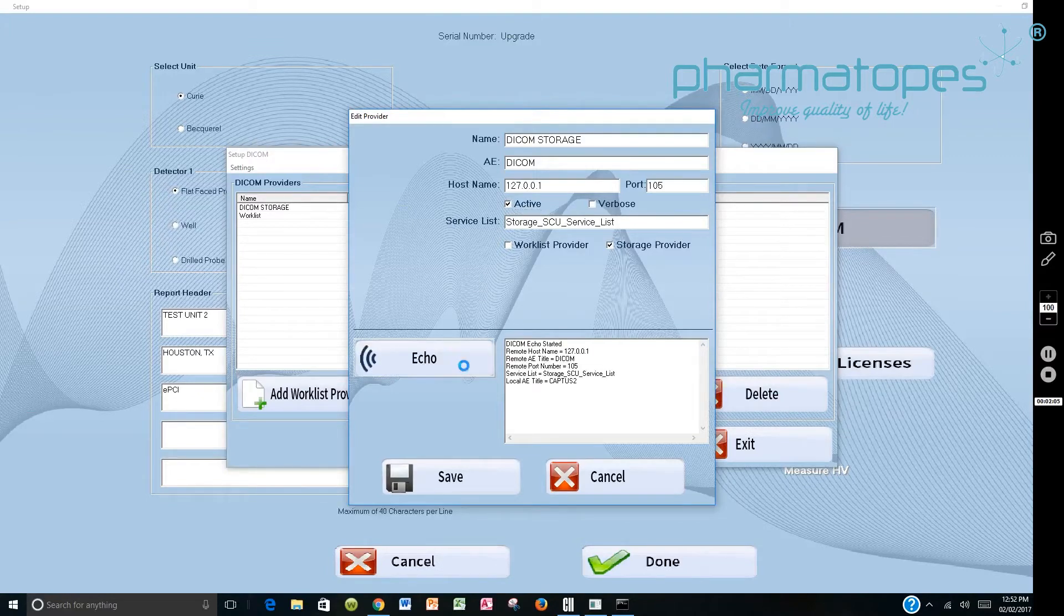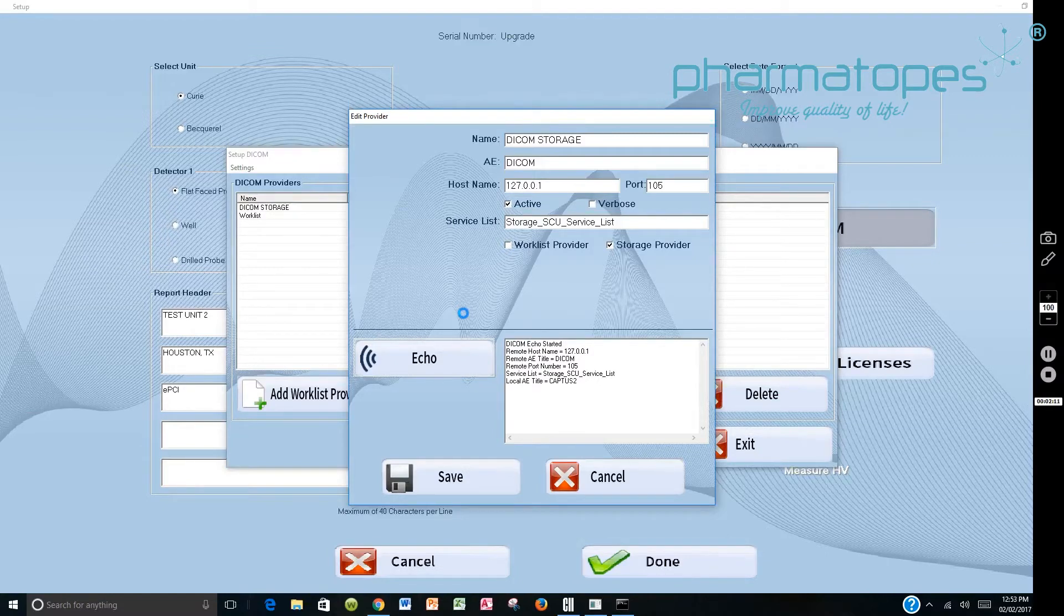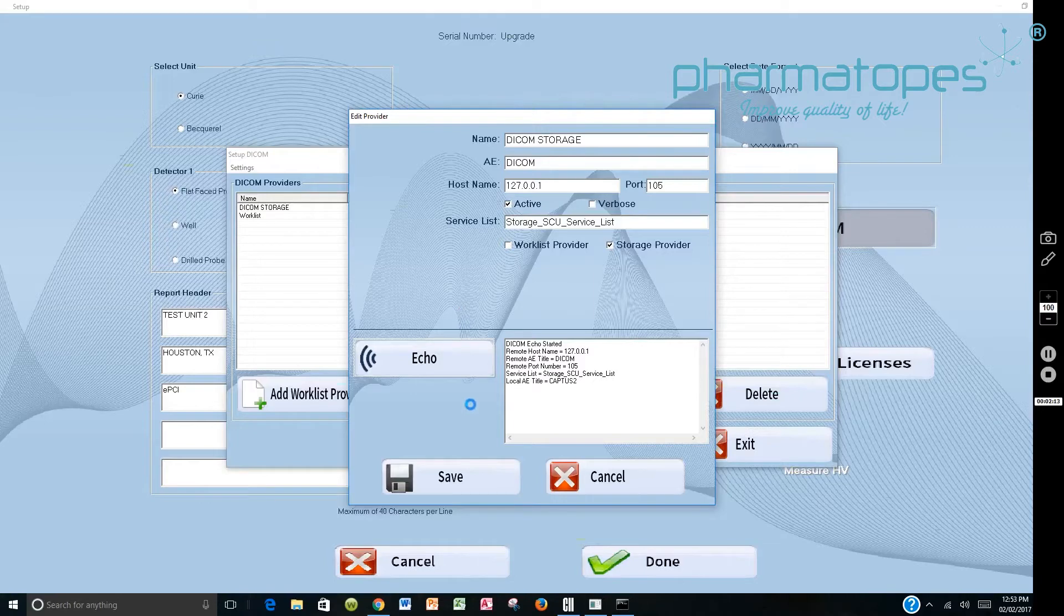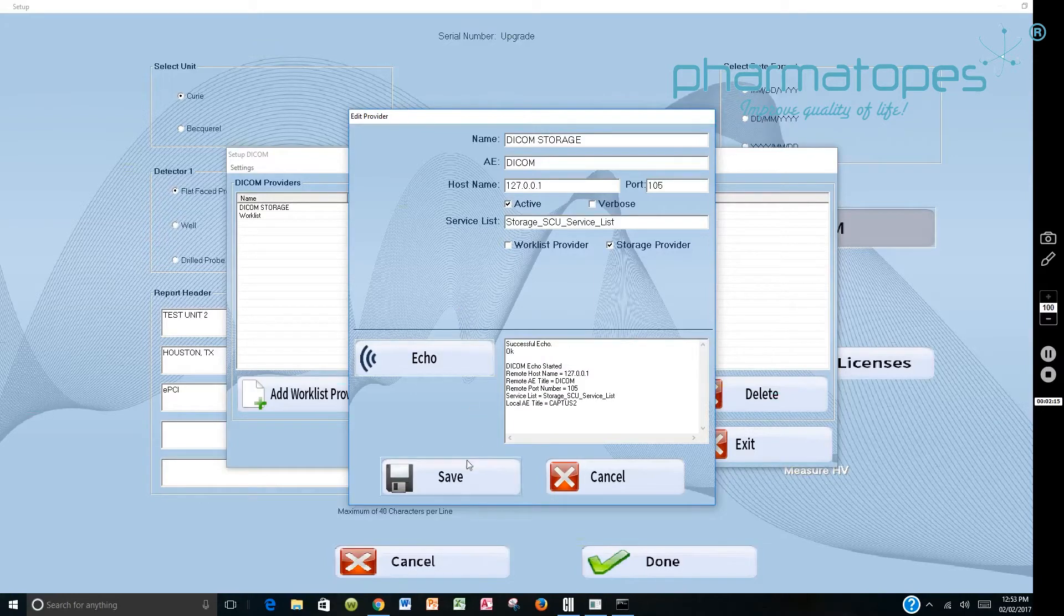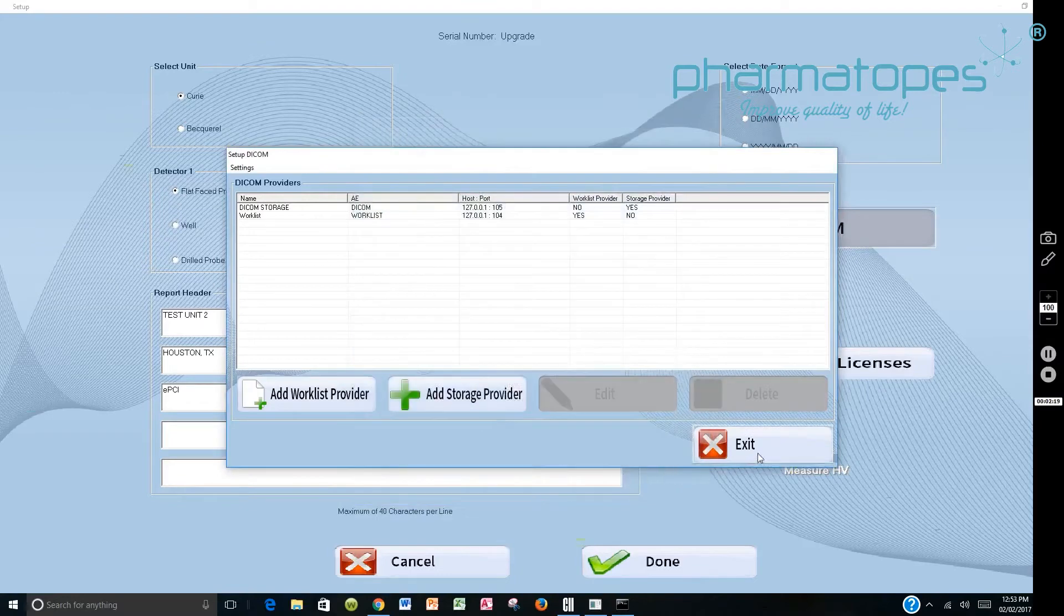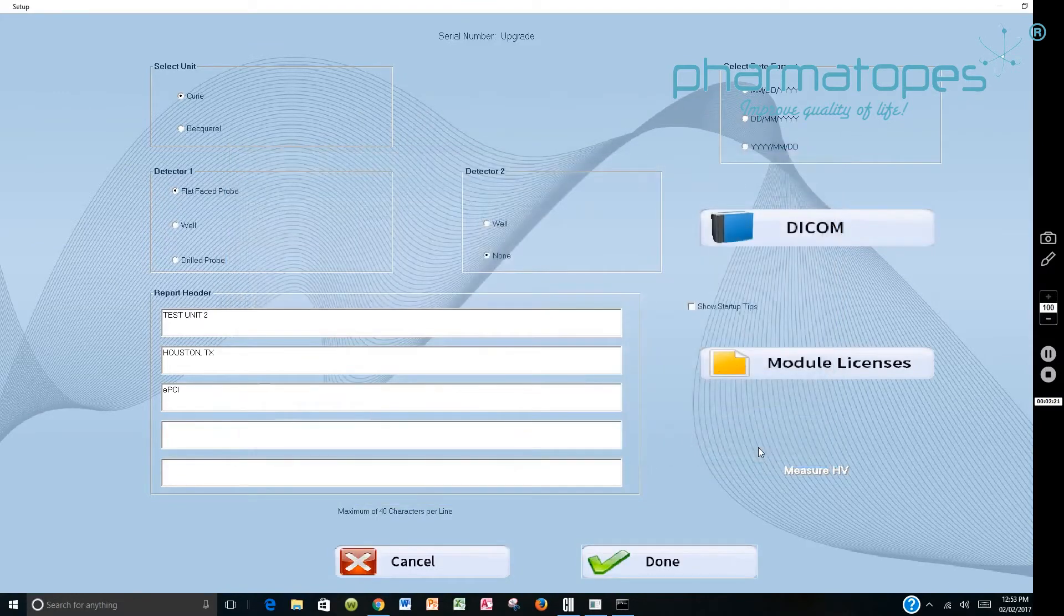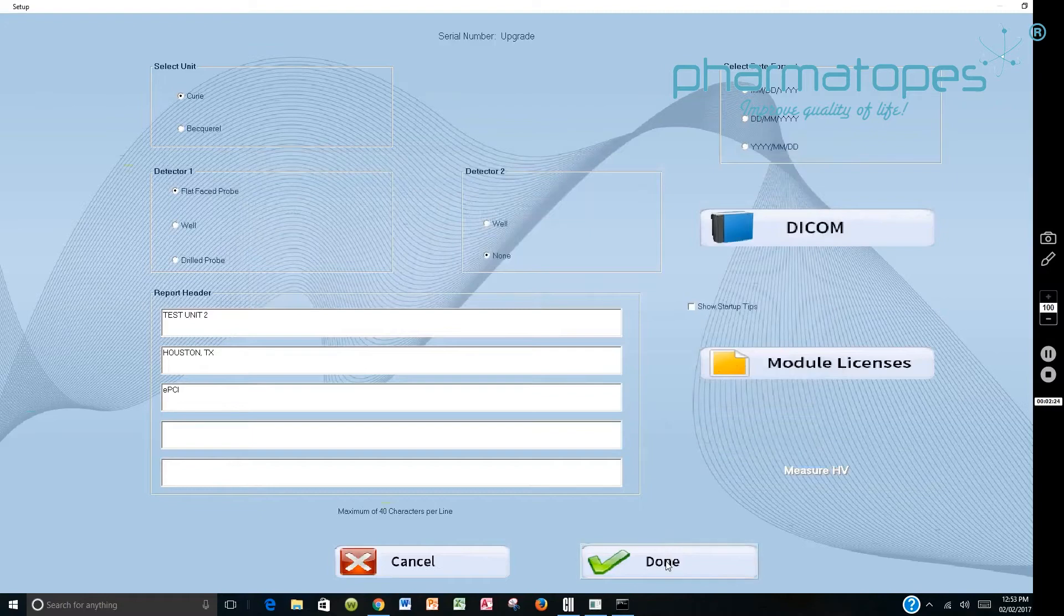You would Echo, and we're echoing to see if the DICOM Storage will communicate with the CAPTIS 4000E. If it communicates, then we will say Save down here, and it communicated, and then we're ready to proceed with our thyroid uptakes. We've got all the information in, so we would say Done.